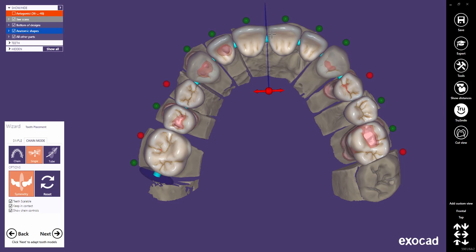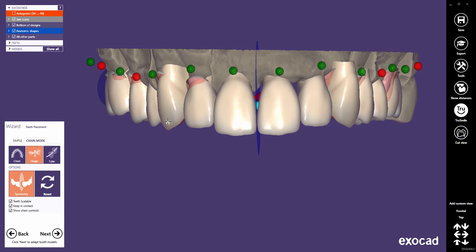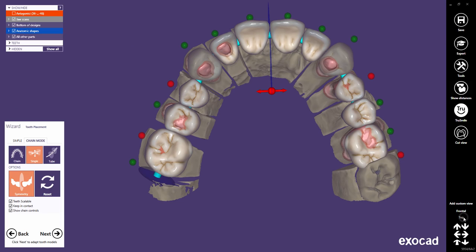This makes it very easy to design symmetrical anterior setups. Note that in symmetry mode, even changes on control points will be mirrored. A simple click on the symmetry button deactivates the feature again.